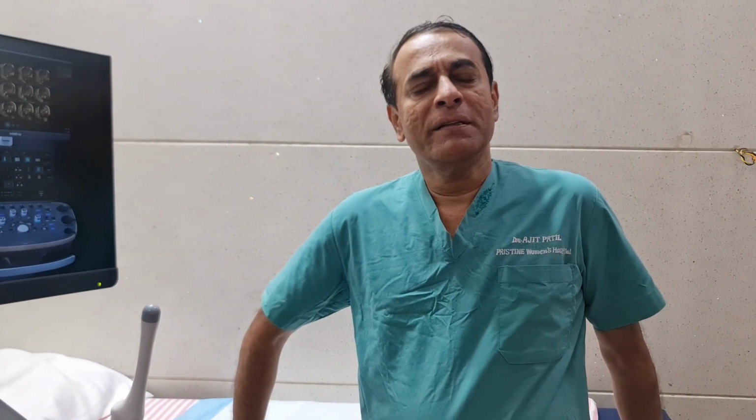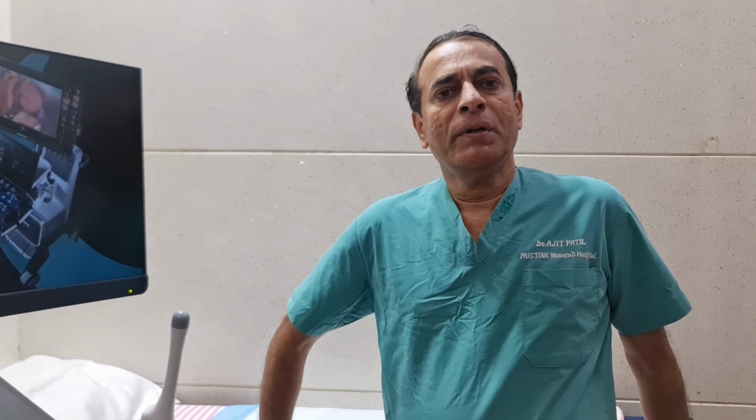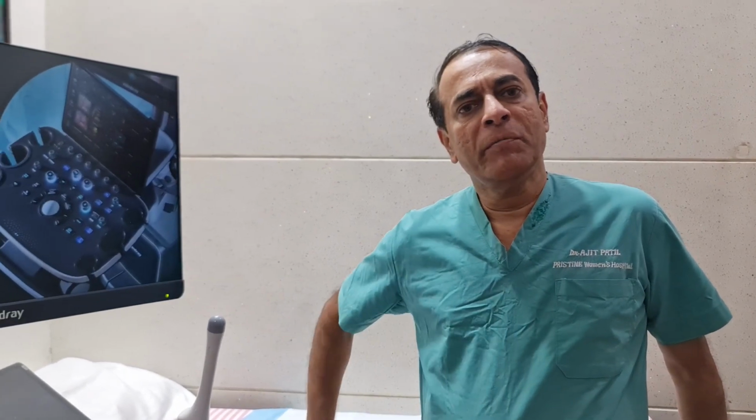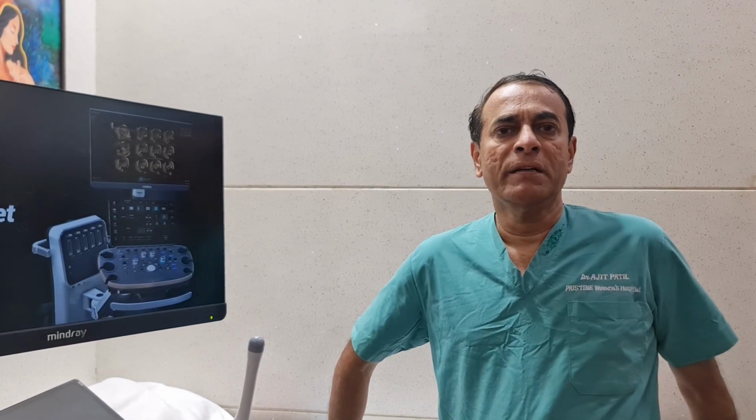Screening for pre-eclampsia during pregnancy has become standard of care worldwide. And today in this short video, we will see how ultrasound can become an important tool for screening women and assessing the risk of preeclampsia.